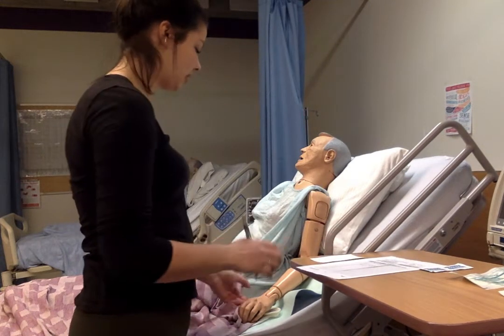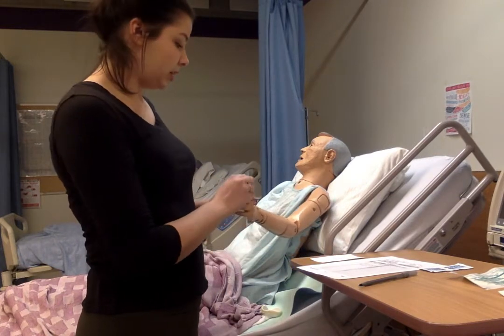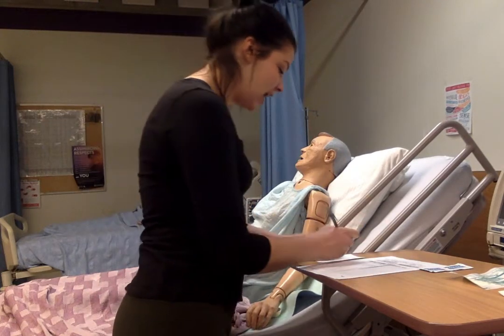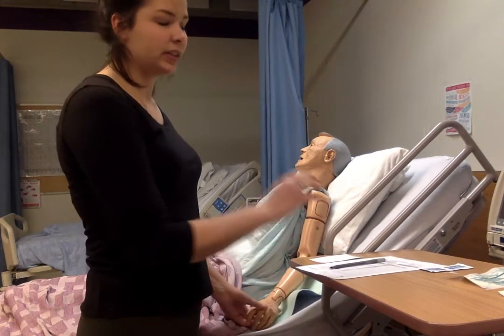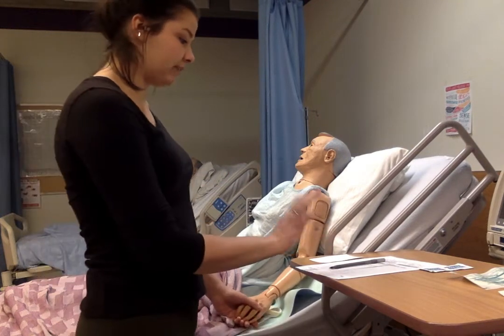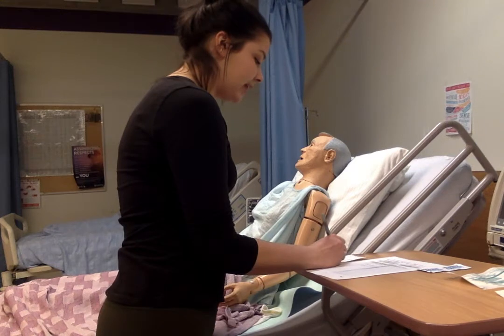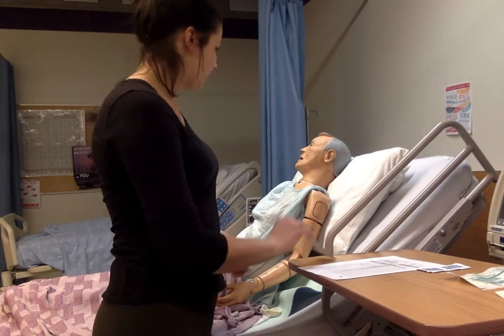And then I would want to be taking some vital signs, so I've hooked him up to his SpO2 checker, and it's good. He's sitting at a 98, so I don't have to worry about that. His vital signs, as far as his temperature, pulse, blood pressure, they were all in normal ranges, so I have nothing to worry about there. And Rupinder, do you have any allergies? And he's telling me he's allergic to peanuts, so that is a dietary issue, not so much my drug issue, but we are aware of it.